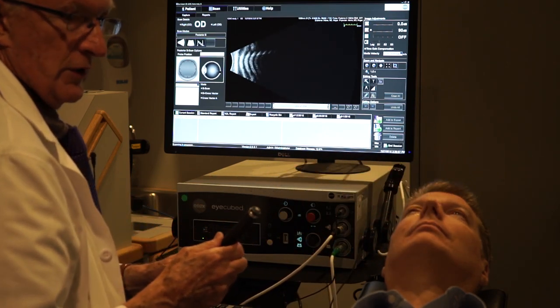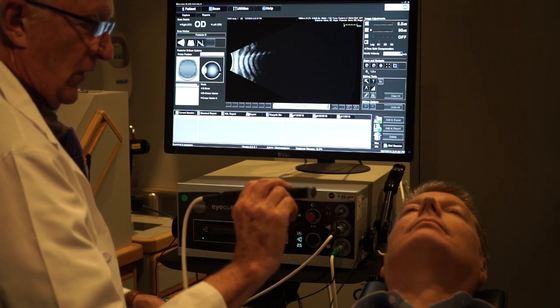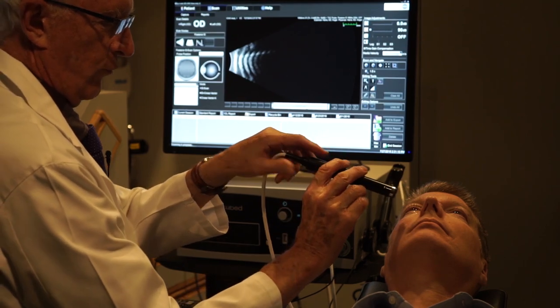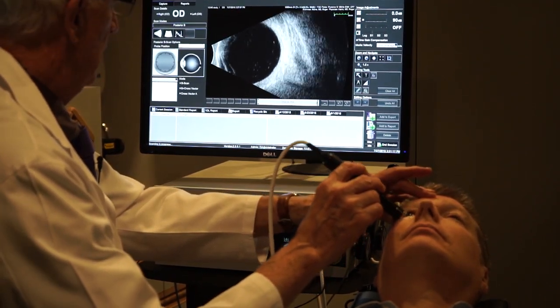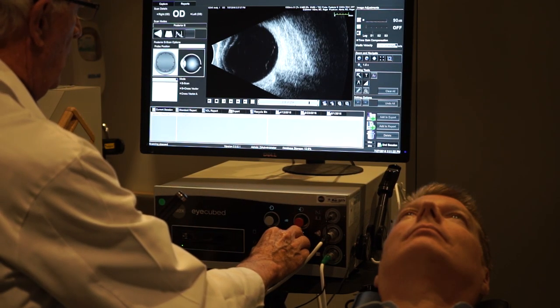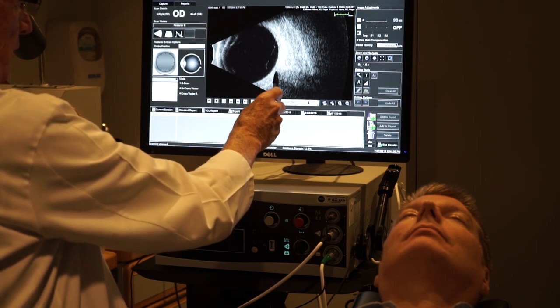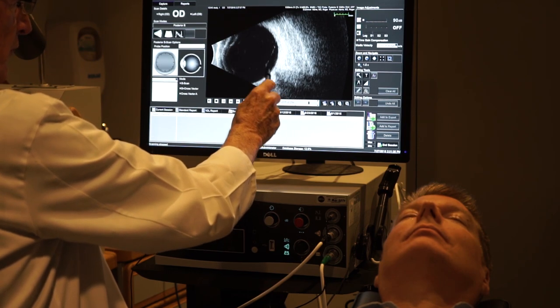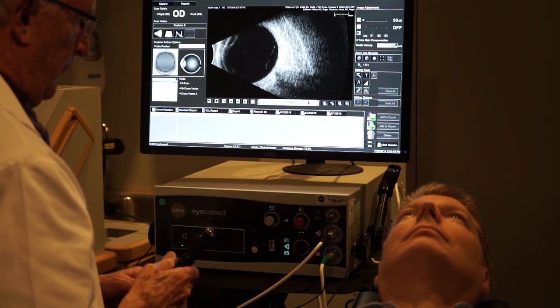A major landmark for probe position is the optic nerve. To find it, I position the probe so the marker is oriented nasally, pointing towards about five o'clock, and the nerve just pops up. Here's the globe — front, back — and here's the optic nerve shadow, which is a V-shape or other dark shape. When you see this darkness, you're at the optic nerve, which orients you relative to other parts of the globe.